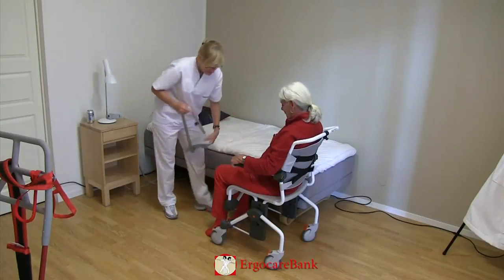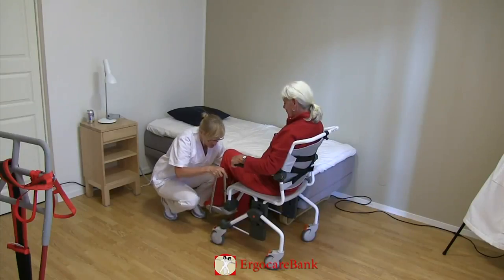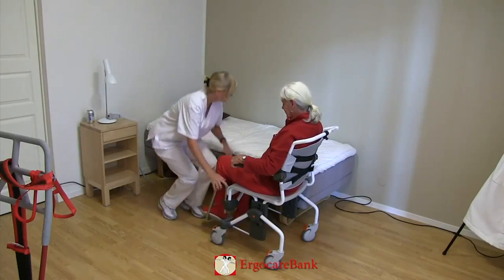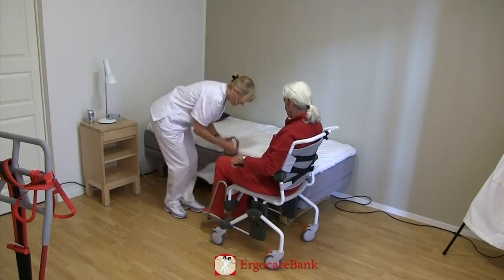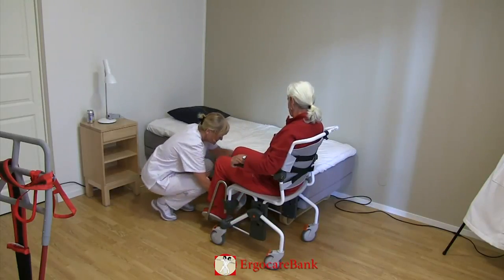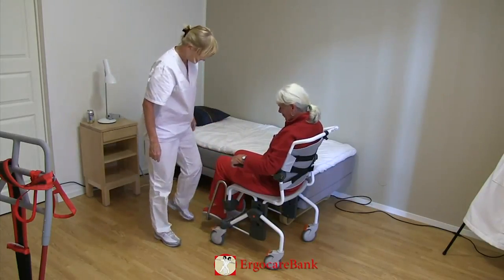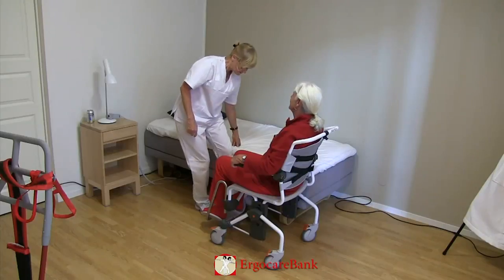The foot rests of the shower chair are put back on, and the brakes of the shower chair are unlocked.